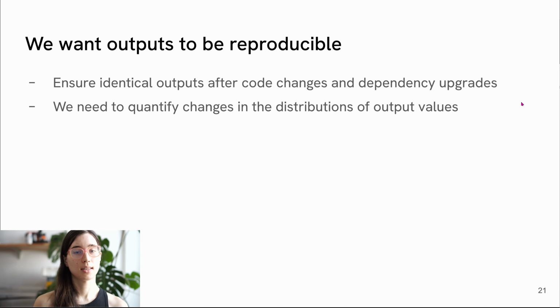But the problem is that the goal of HALFpipe is that we want to be very reproducible. So whether you ran HALFpipe 5 years ago or last week, we want users to be able to combine those into a meta-analysis. But this is not necessarily the goal of all of our dependencies.